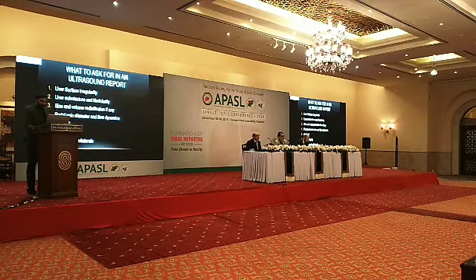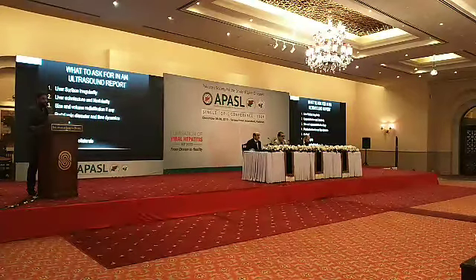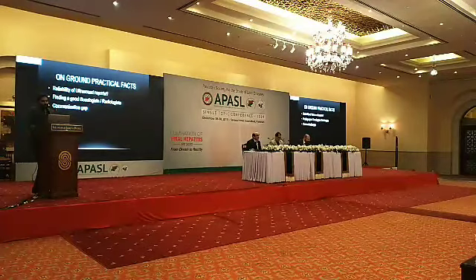So all these are technical points, and you should know them as physicians, because you should expect that information in a report. So again I'll repeat the points: liver surface irregularity, echo texture, nodularity, the size of the liver, the volume redistribution, is there ascites, portal vein diameter, the direction of the blood flow in the portal vein, is there splenomegaly, are there varices present, and obviously is there any mass, which we'll touch upon in the next part.